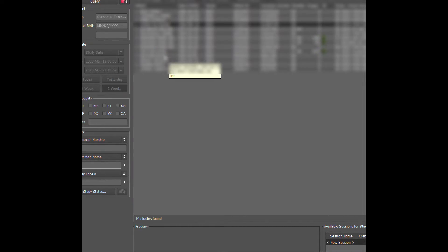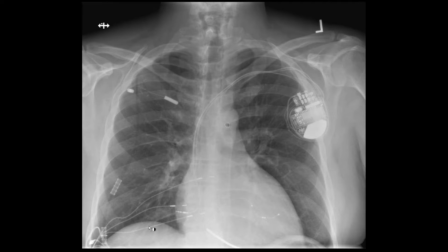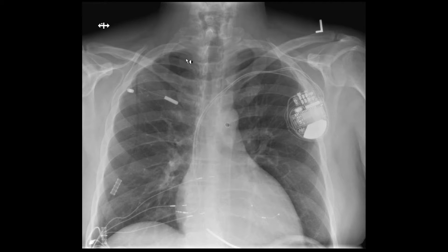A more recently developed related device is essentially a long-term balloon pump, with the brand name New Pulse IVAS. It has an interesting appearance with implanted ECG leads — the balloon pump is triggered by the ECG so that it inflates in diastole and deflates in systole. The device itself has some air in the line and a marker visible in the proximal descending aorta. This long-term balloon pump is an alternative to a long-term LVAD because it does not require sternotomy.